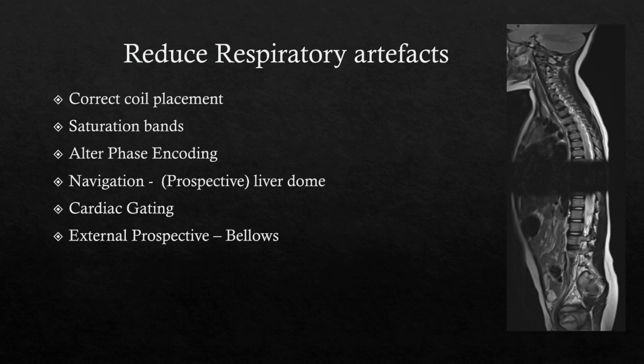However, when we're scanning pediatrics, we scan a variety of ages from very small to adult size. So for a lot of our patients, that probably wouldn't work as their chests will not land in the correct place. But I can see how that would be very helpful for adult centres and adult populations who are generally mostly about the same size, and their chest will be in the correct place in the scanner.